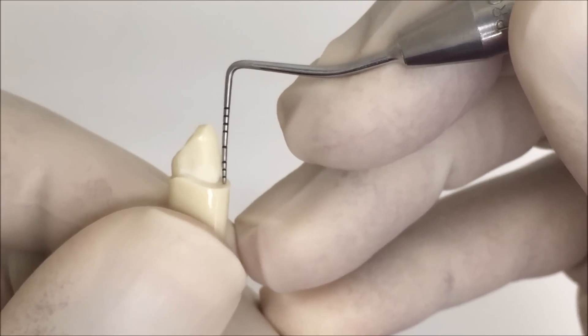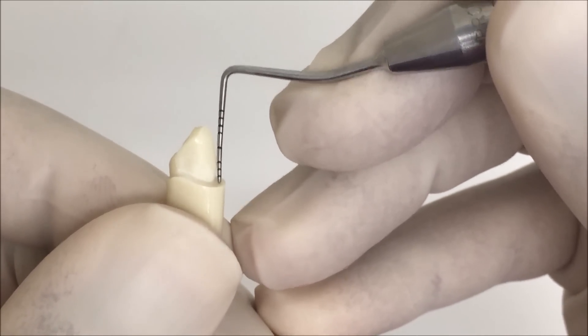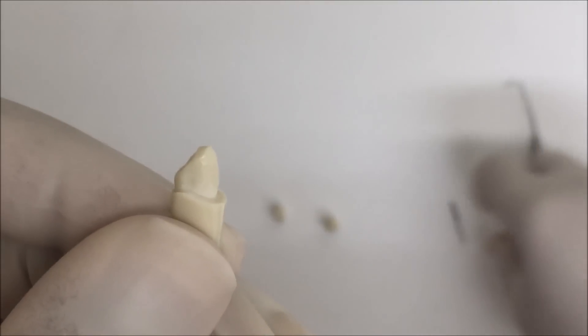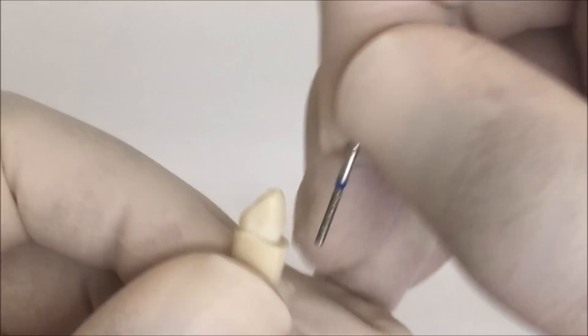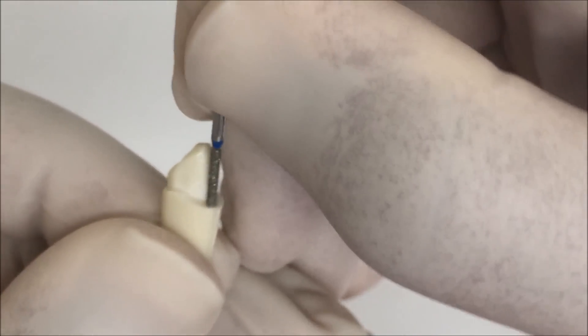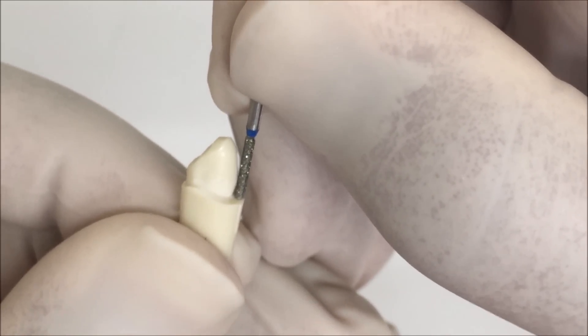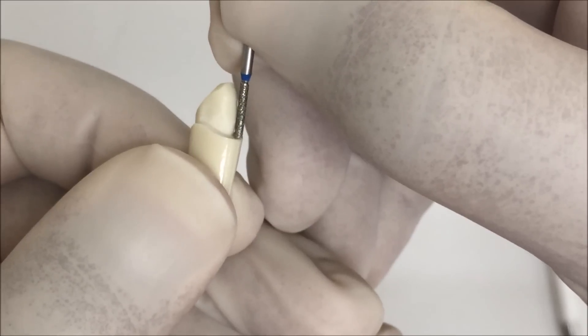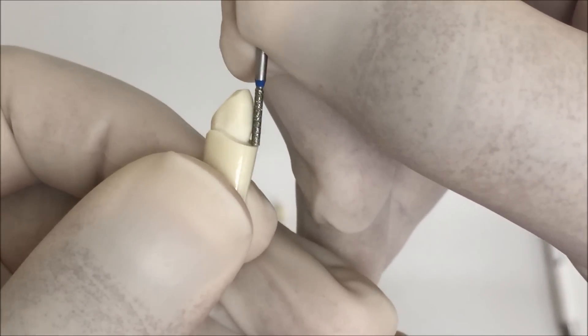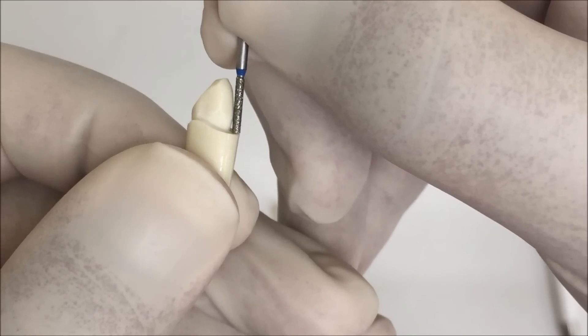Also, you can put the bur that you are using, just try to put it parallel to the surface on the margin, and you will get that triangle I am talking about. You can see it's obvious here.